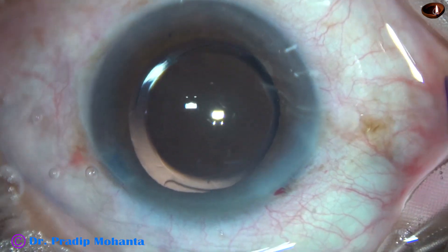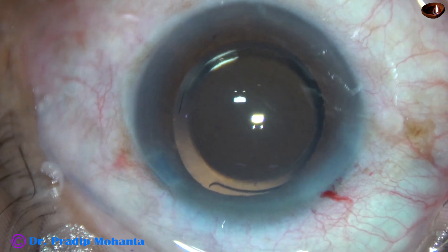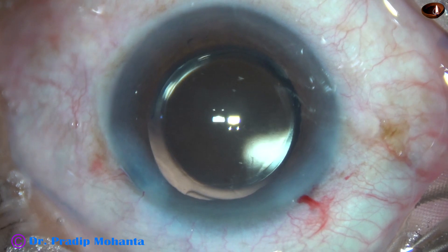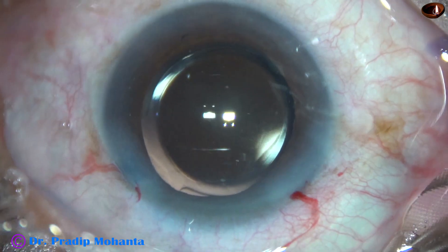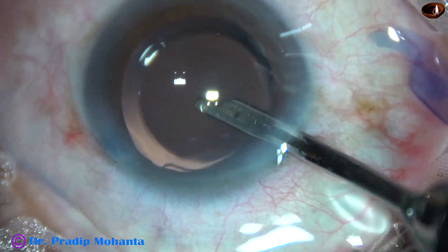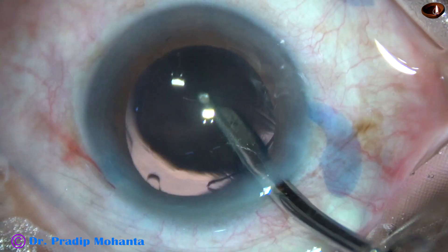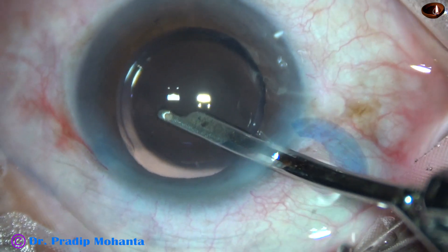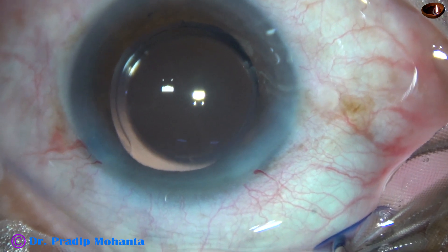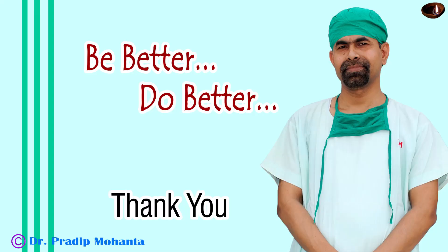The case is done — we just have to close the side ports. This is a bit of moxifloxacin. The side ports are closed by hydrating the corneal stroma on either side of the stab incisions. And now this is the final lavage of the anterior chamber. Whatever visco sticks to the corneal endothelium is removed at this time. The anterior chamber is formed very nicely, and the integrity of all the wounds are checked with a cotton-tipped applicator.